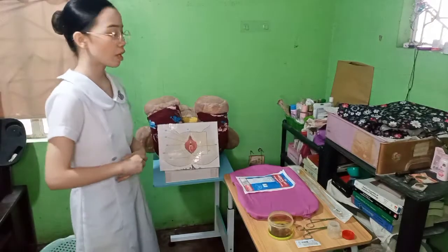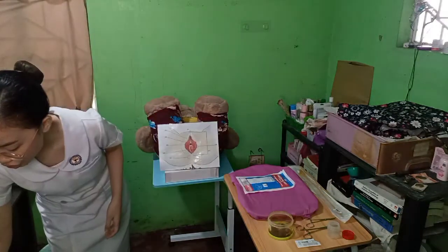To begin the procedure, we'll perform first the assessment. Review the need for perineal care. There are some instances in which our client can perform the perineal care by themselves, and there are also some clients who are unable to do necessary activities for themselves. That's why we need to give them our assistance. And then check order for catheterization, check the patient's chart, and check the client's record or history to be sure that this procedure needs to be given to the client.